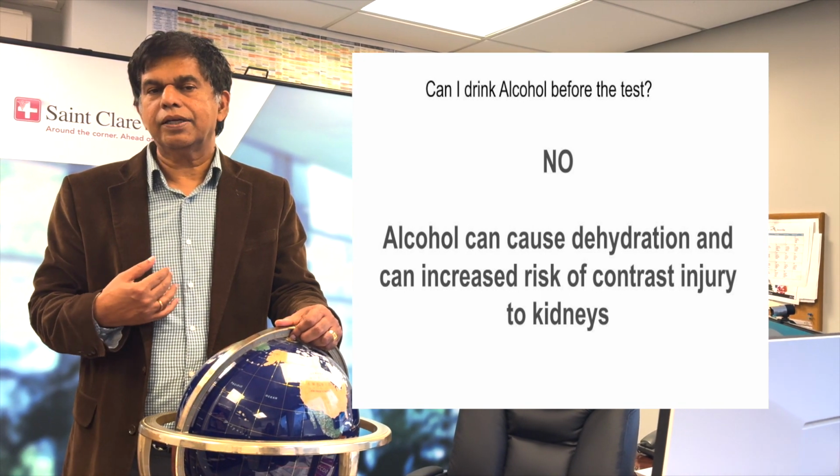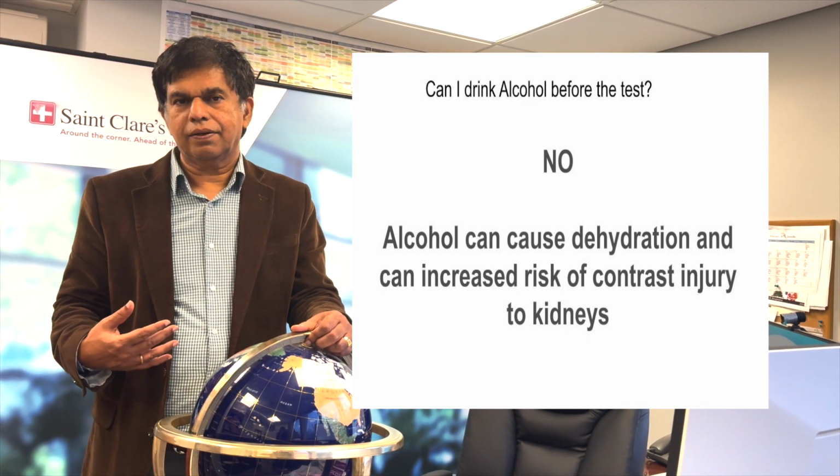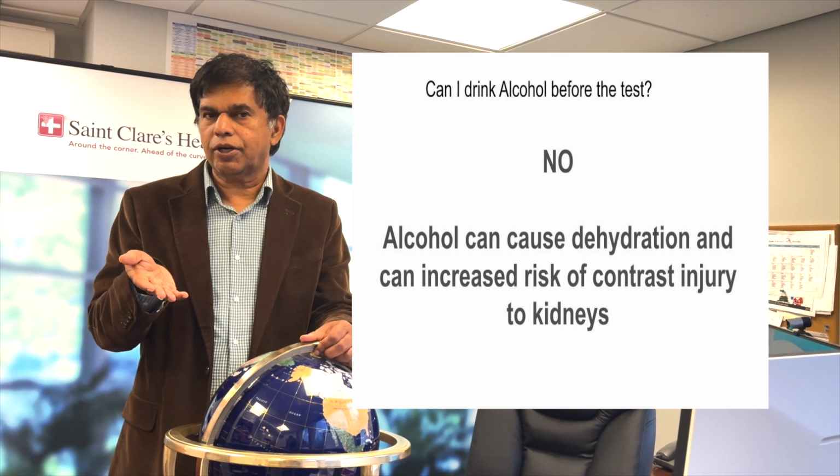When you have dehydration, when you have to do a contrast CT, again, I told you it can affect the kidney, right? When you're dehydrated, kidney function can be affected, so don't do that. I would stop alcohol 2-3 days before.